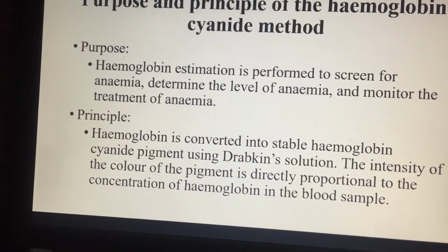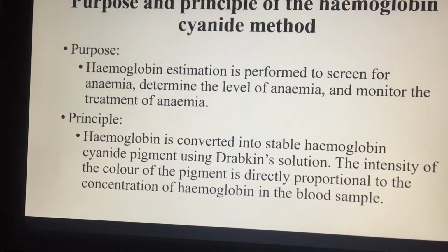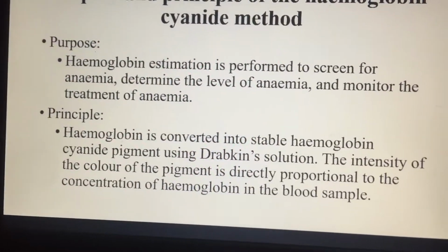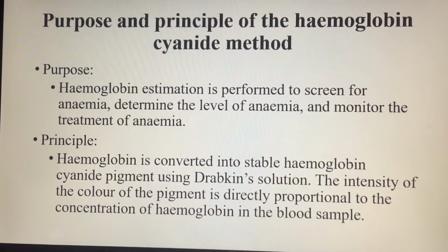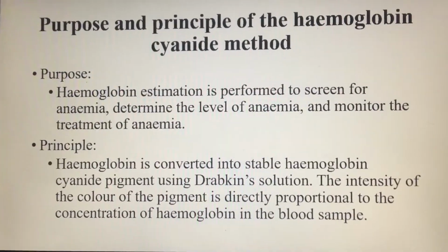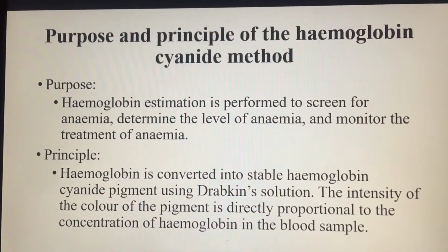It means to know the anemia condition, and also to determine the level of anemia in an individual, whether it is severe or mild. Also, to monitor the treatment of anemia.